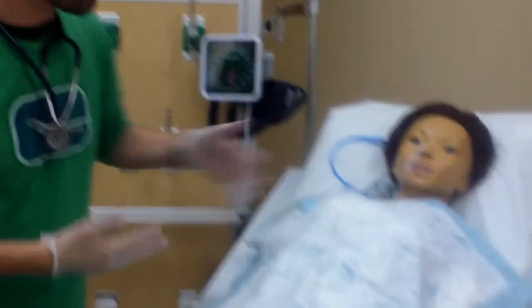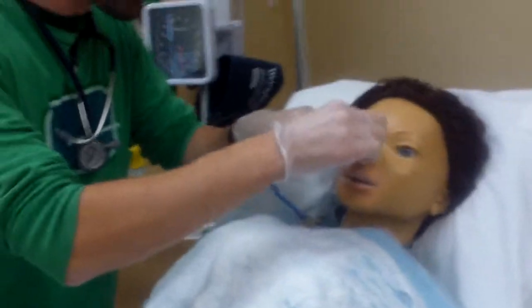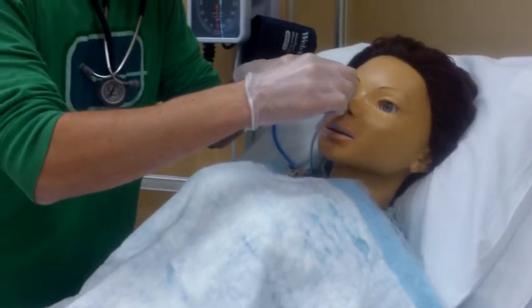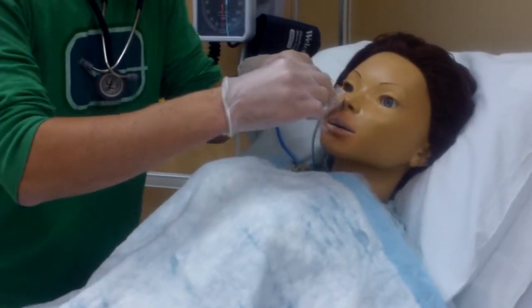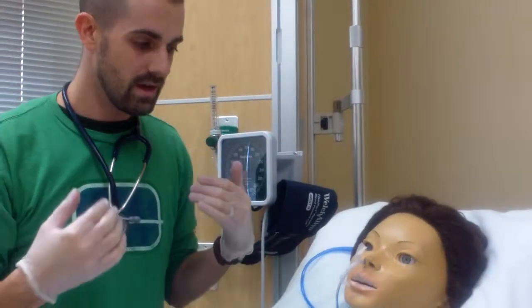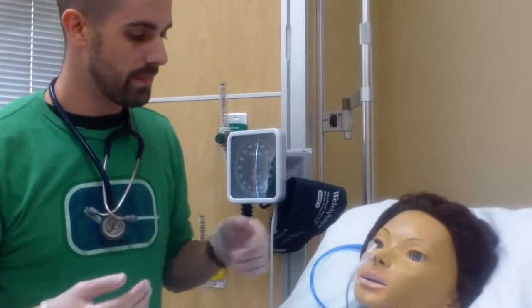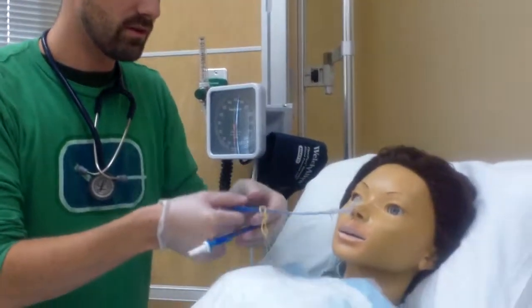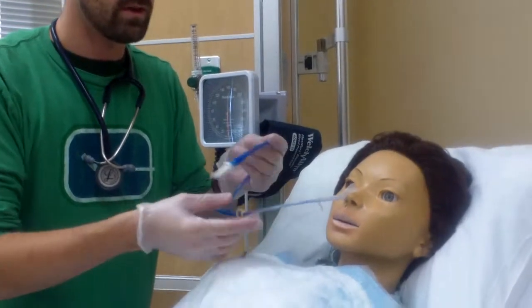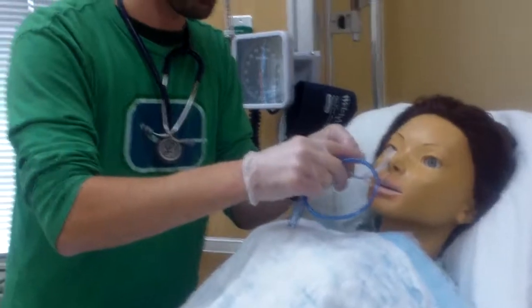So it is unclamped. This tape is on there, so I'm going to carefully peel the tape off their nose, trying to be very sensitive to their skin. If there's any kind of sticky residue, any of that kind of goop, I would use the special adhesive removal stuff. And then I would tell them that I'm going to do this, so I would need to clamp. I'm going to try to wrap this around. I'm going to clamp the tube so then I can kind of fix it.